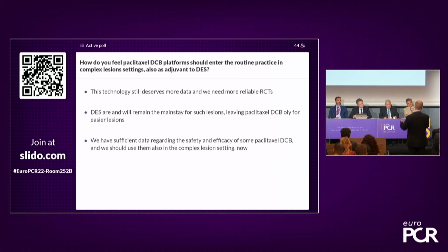The patient had to come back for another procedure. The patient ended with 2 balloons, and then in the second setting with 2 stents, and then needed an OCT to prove the result. I think, from my perspective, if we are to compete with stenting, we need to streamline the procedure. We need to gain the confidence not to be bringing the patients back routinely, not to be implanting a second stent. This is economically not a viable option, at least in my perspective.